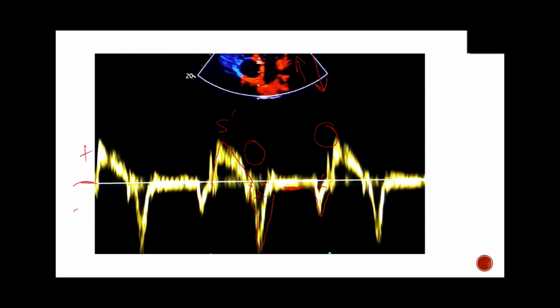Or if they're exercising, say they went out for a run and you check their tissue Doppler right after, you're going to see more exaggerated tissue Doppler velocities as well. So this is why diastolic dysfunction and using your E waves and your E primed waves in a young healthy person is less reliable, because there's an active component. And we'll go over E primed later.